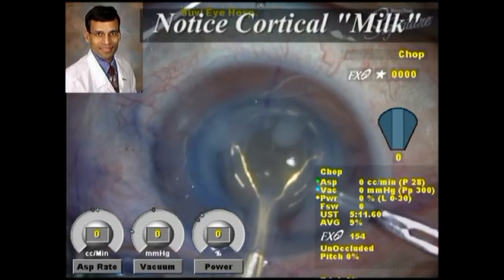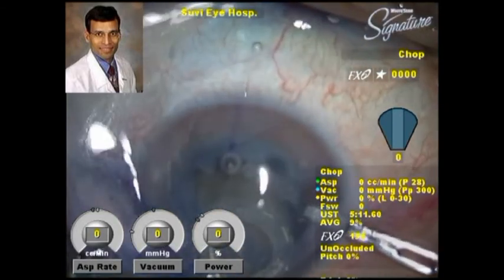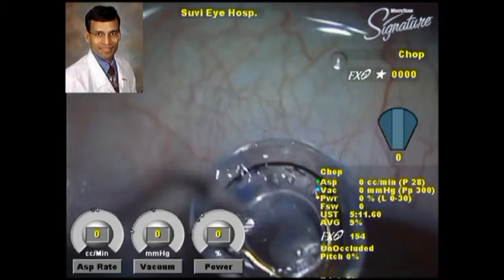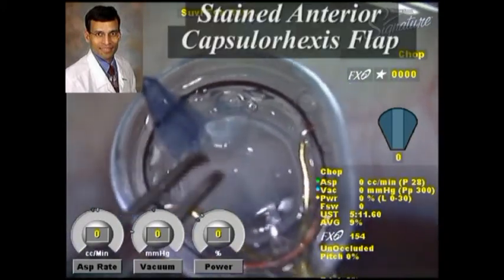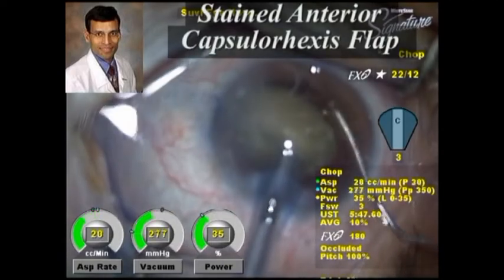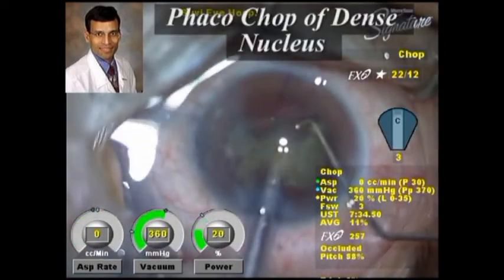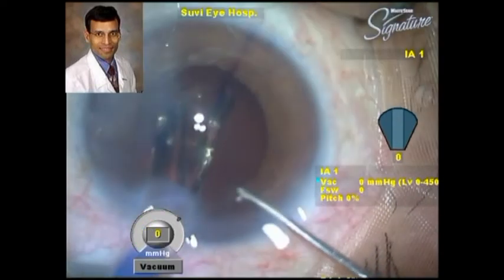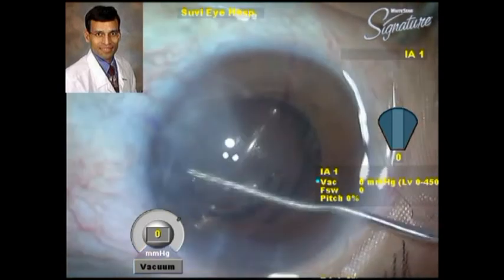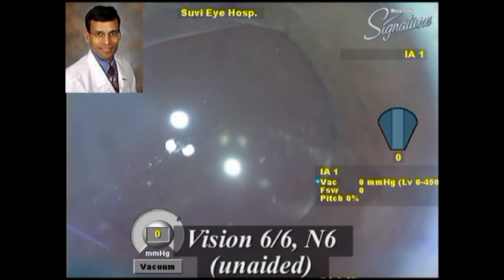As we can see here, this is a hypermature cataract so a lot of fluid has come out immediately after the capsulorrhexis, and it is quite evident that a forceps-created capsulorrhexis would have been extremely difficult and risky in this case. The cataract is quite hard and is being removed in the normal manner using standard precautions. We then implant the toric multifocal IOL, and a well-centered IOL can be seen.